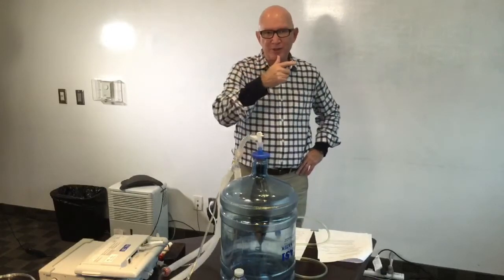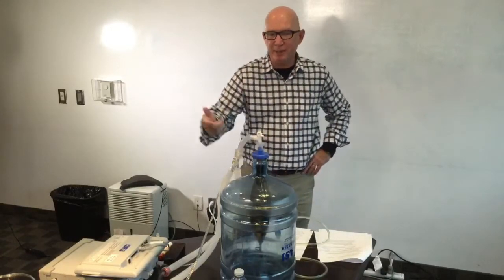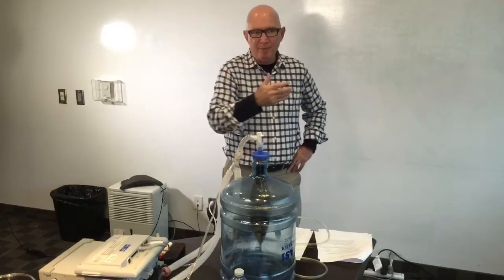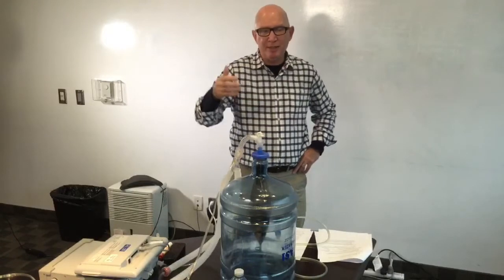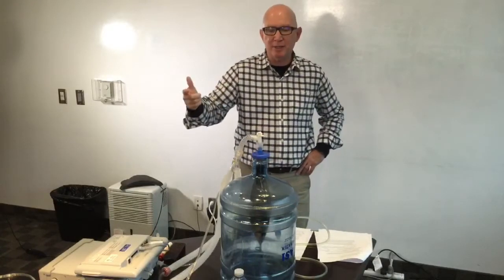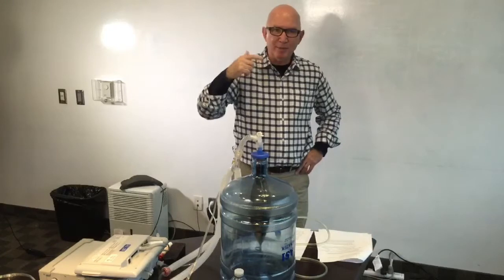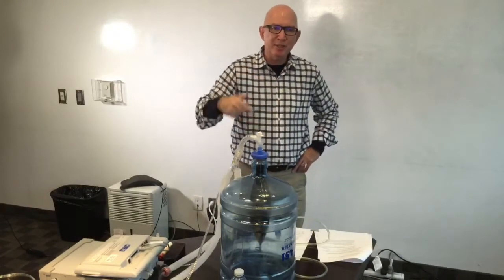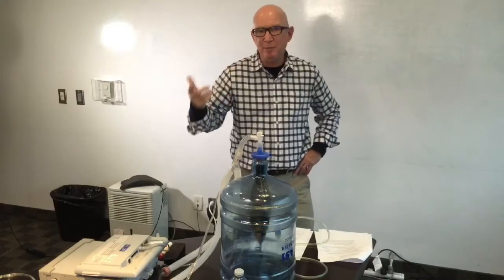So the first 16 breaths they're breathing along with the ventilator. And they may trigger those and they may not trigger them. It could be that they simply inhale right along with the machine's rate, but the additional 4 breaths, they are going to trigger those. And what I'm suggesting now in regards to this SIMV question is that those additional breaths should ideally be AC breaths.